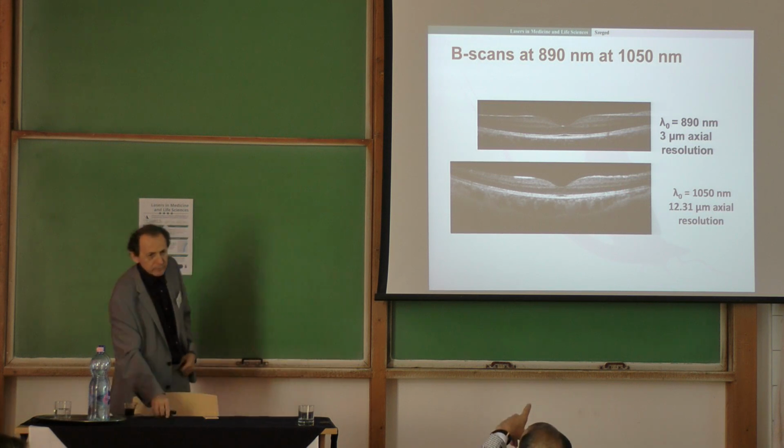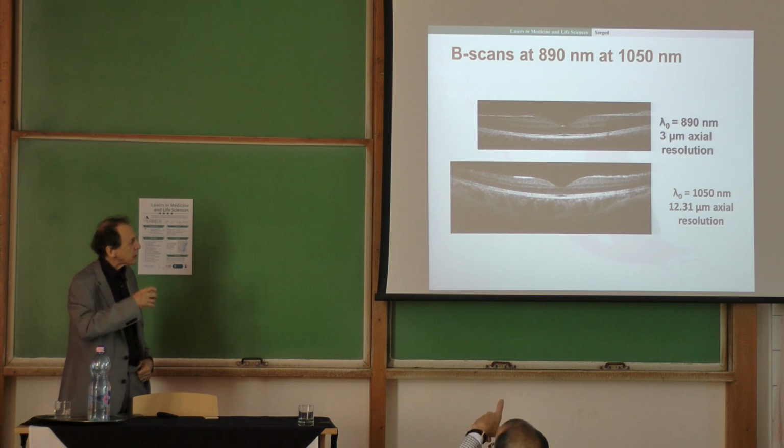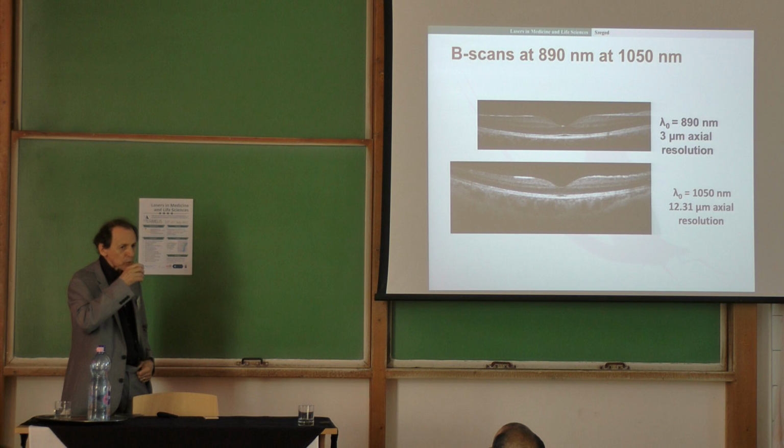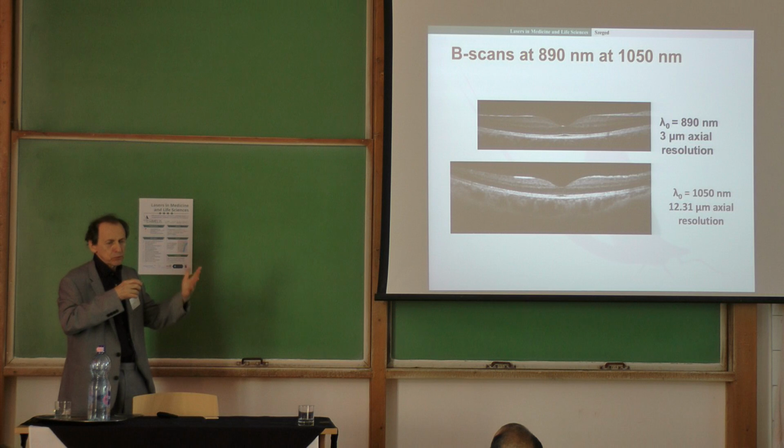Excuse me. This condition is for wavelengths. I didn't get the question. This is optimum conditions for the wavelengths. What do you call by optimum? They are both optimized OCT systems to work.